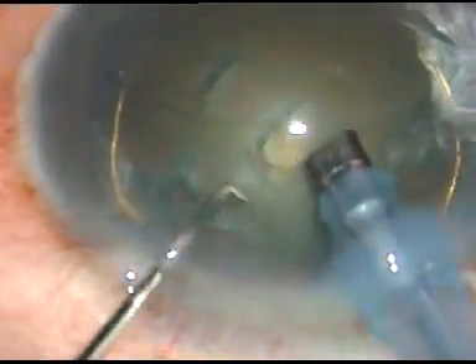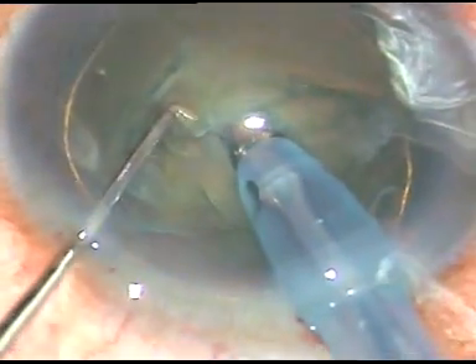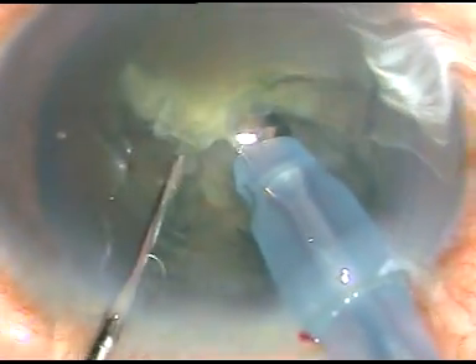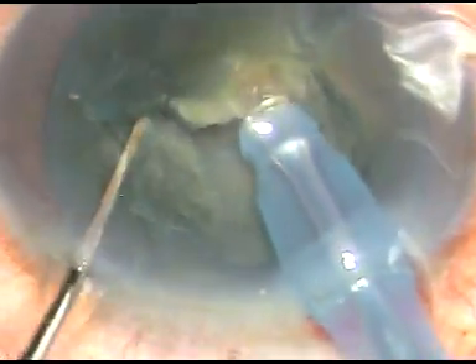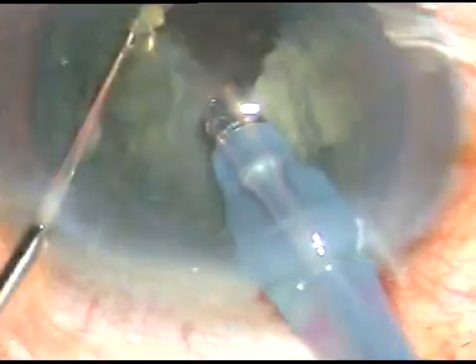And here I reveal a secret to you. I use FACO energy in continuous mode, not in pulse mode. I repeat: FACO energy in continuous mode, and use it only when something is occluding the FACO tip. If there is nothing occluding the FACO tip, I don't use the energy. Thus, I prevent heating the FACO tip.